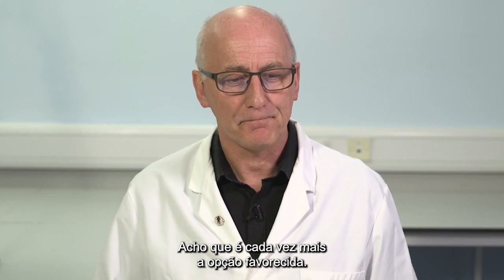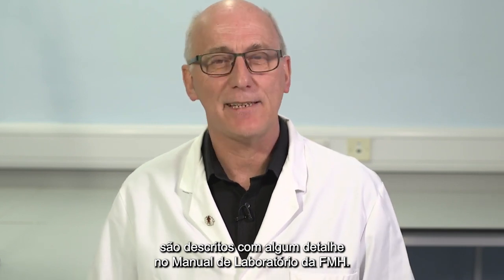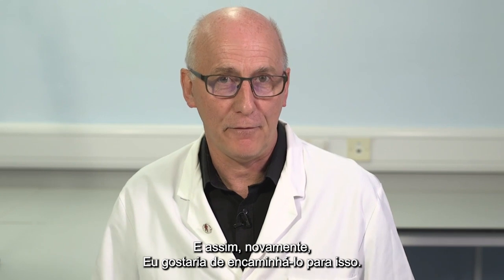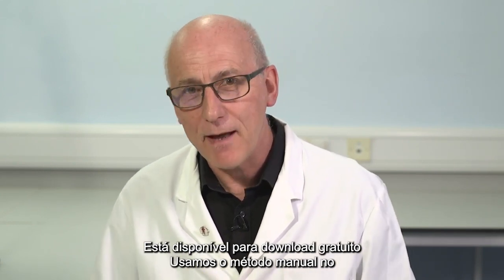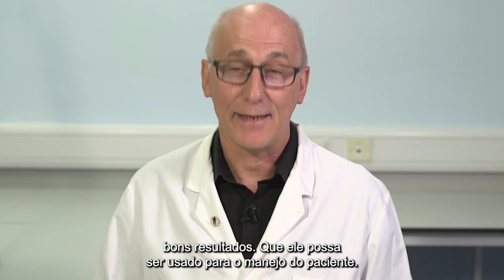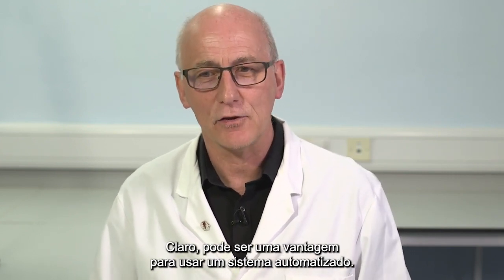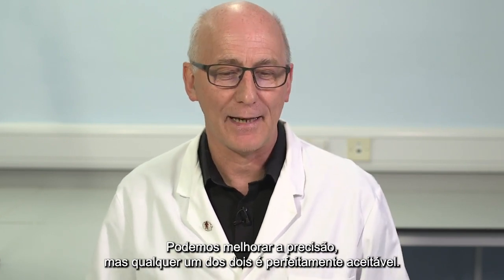increasingly the favoured option. All of the techniques that we've described and that we've demonstrated are described in some detail in the WFH laboratory manual, and so again I'd like to refer you to that. It's available as a free download. We've used the manual method in the water bath, and I hope you can see that we're able to obtain good results, that it can be used for patient management. Of course it may be an advantage to use an automated system. We can improve the precision, but either is perfectly acceptable.